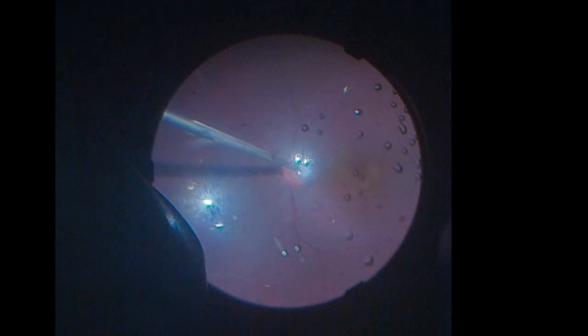Then again the forceps was used to tuck the graft in the pit and then the residual fluid was aspirated by the cutter. So basically our graft was hip hopping and dancing all over until the retina was completely dry.